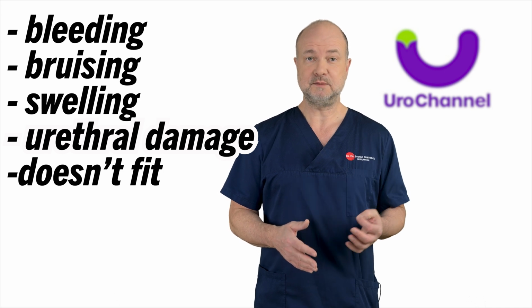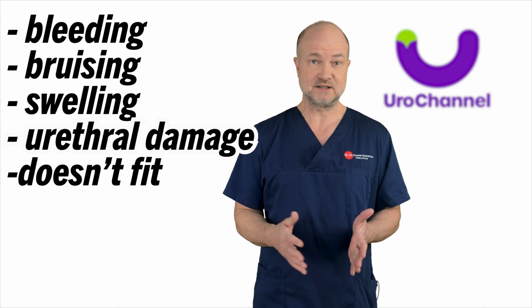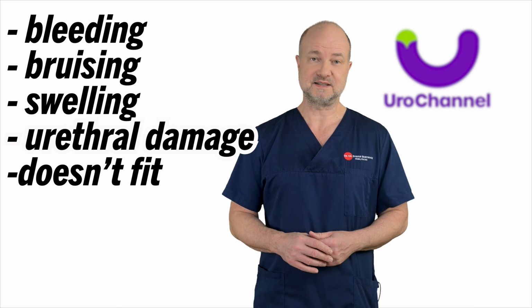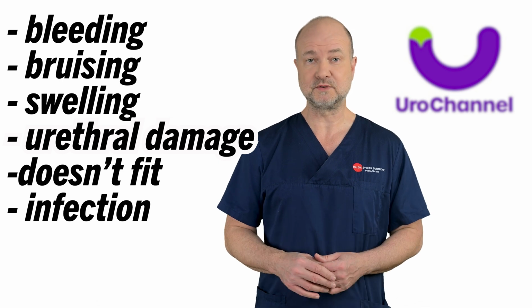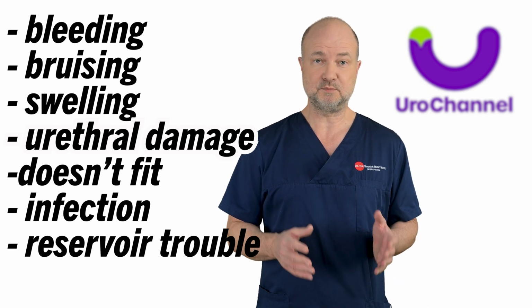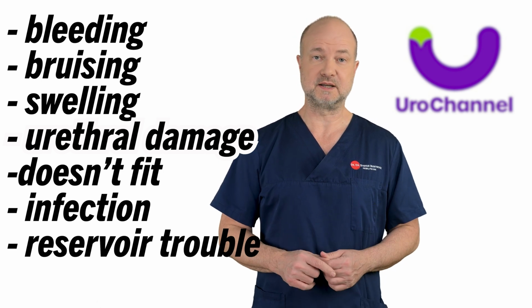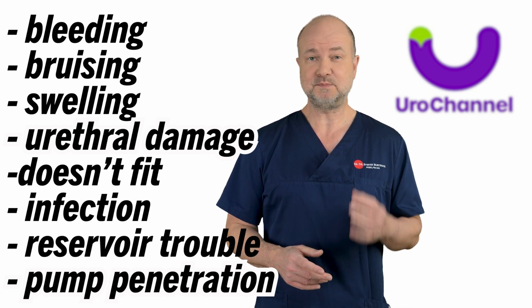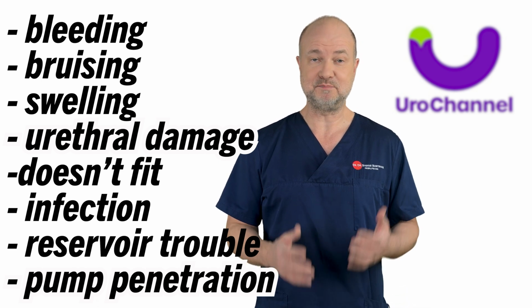If it is too short, the tip of the penis will not get hard, but stay soft and wobbly when the implant is activated. If the prosthesis is too long, with time it may eventually come out at the top of the penis. However, this is not commonly seen. In 1 to 4%, there may be an infection. Commonly, the prosthesis will have to be removed. In rare cases, particularly in patients with prior pelvic surgery or scarring, the reservoir can put pressure on the bladder, leading to complications. However, this is uncommon with proper surgical placement. Penetration of the pump through the scrotal skin may also be seen sometimes. Even in the most experienced hands, complications can happen, and if they happen, they can become a big mess.